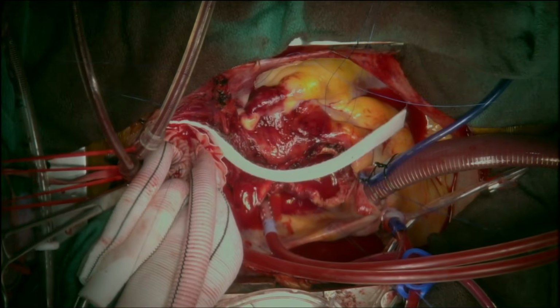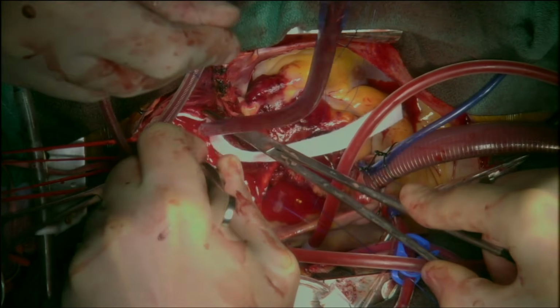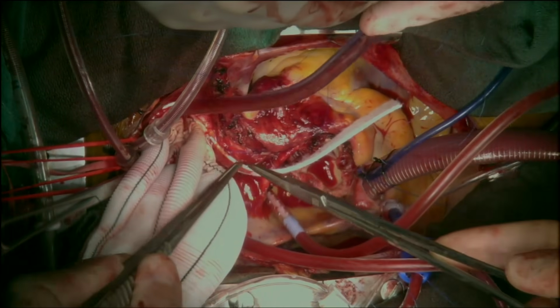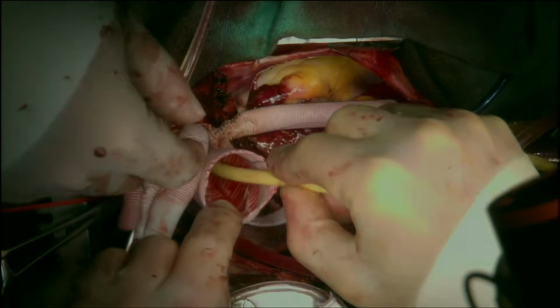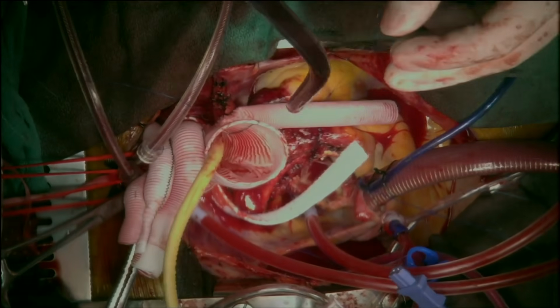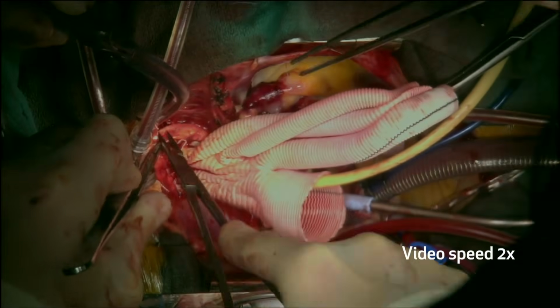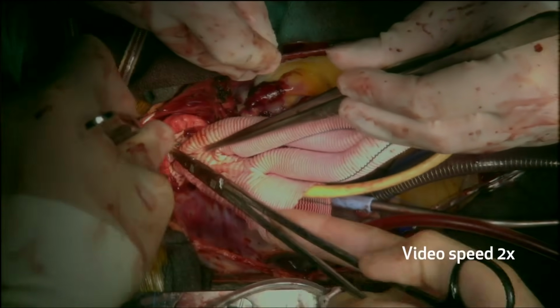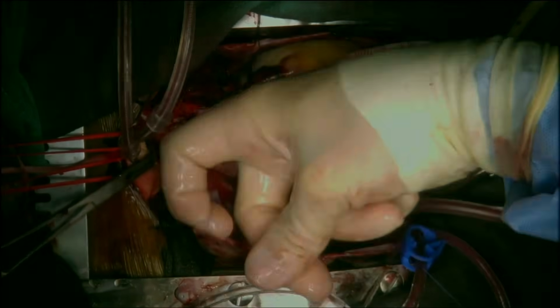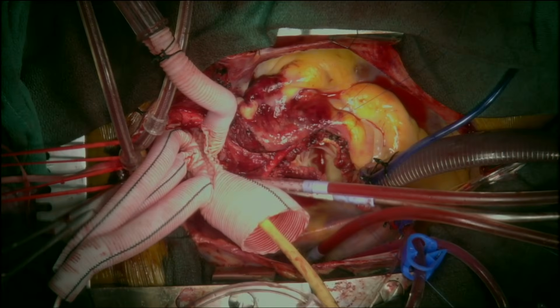The distal cut end of the aorta was anastomosed to the sewing collar of the ThoraFlex Hybrid graft with a running Prolene suture while incorporating a felt strip external to the aorta. A Foley catheter was inserted into the graft and the balloon was inflated to reduce the back bleeding from the graft. After completing the distal anastomosis, the 10 millimeter Anaflow arm of the graft was connected to the arterial tubing.